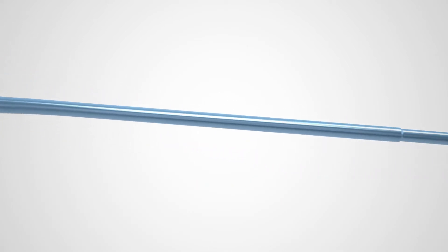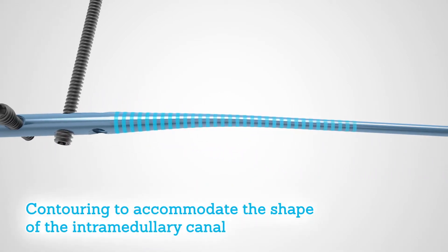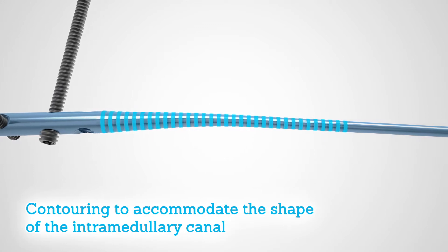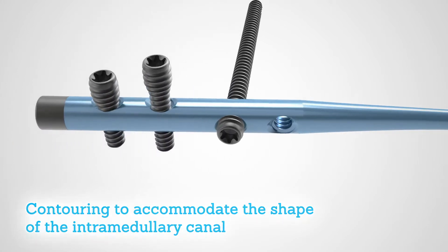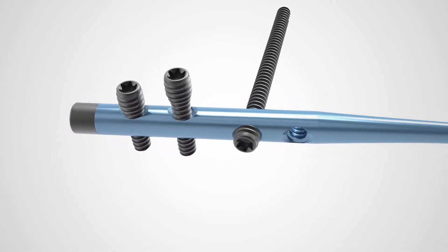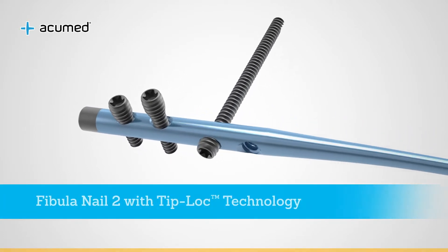The Fibula Nail 2 features contouring to accommodate the shape of the intramedullary canal and targeted interlocking screws to aid in the fixation of common fractures of the distal fibula.